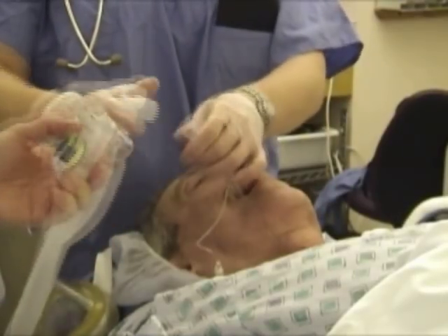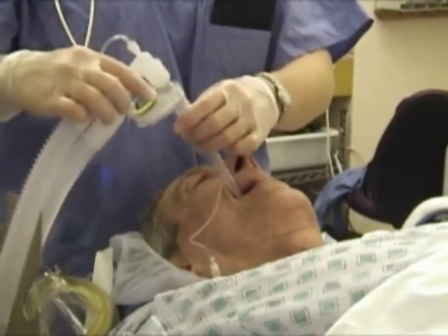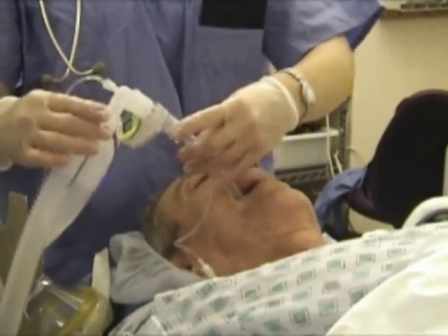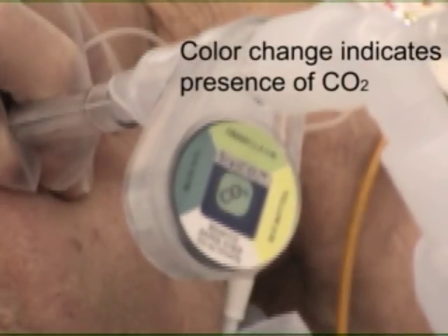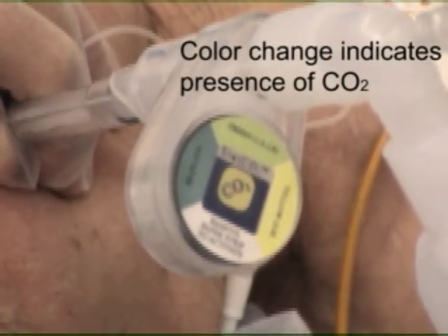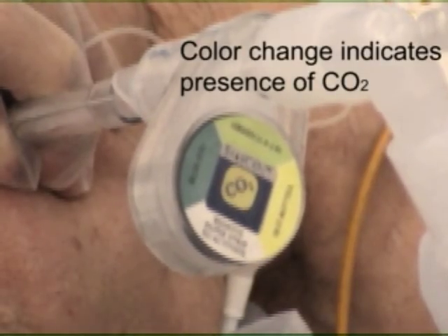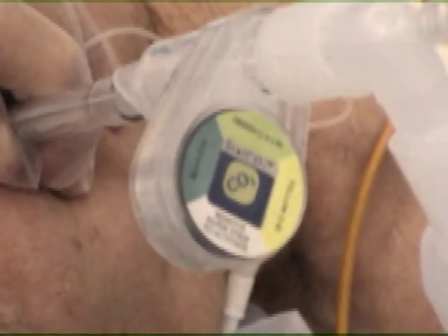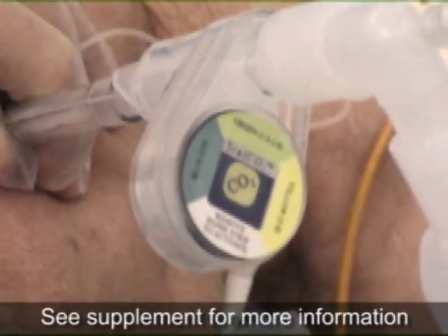Place the end tidal CO2 detector onto the endotracheal tube and attach the ventilation bag, administering a few tidal volume breaths. Carbon dioxide will be reliably and consistently detected within the first 6 breaths of an endotracheal intubation, and with each exhalation thereafter, except in some cases of cardiac arrest when gas exchange may not occur.